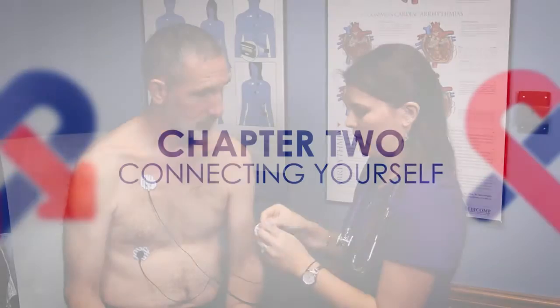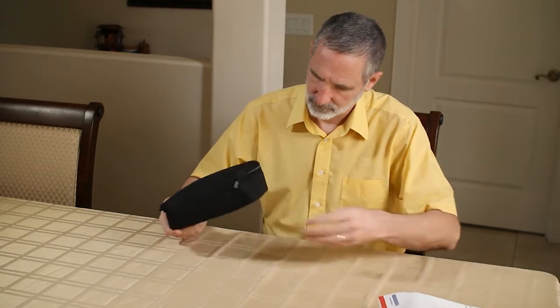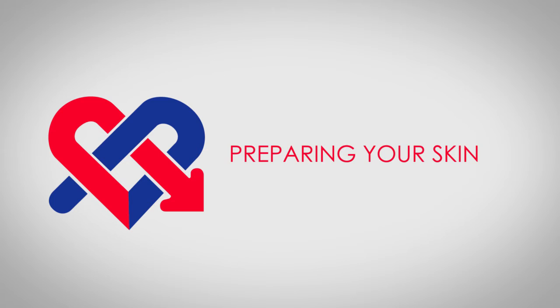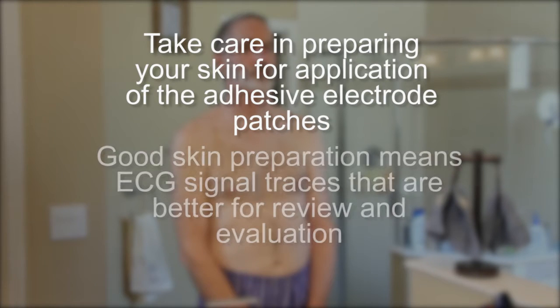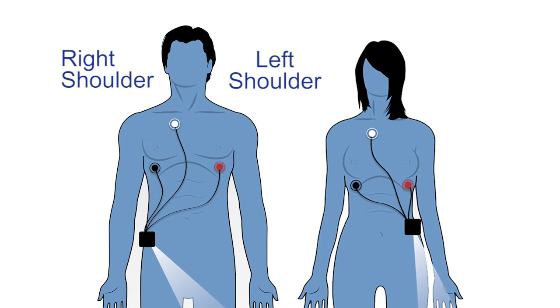Connecting yourself: The doctor's office may have connected you to the monitor, or you may have received the monitor in the mail to hook up yourself. Before applying the electrode patches, follow the steps on how to prep your skin. Good skin preparation means ECG signal traces that are better for review and evaluation. Step 1: Choose areas of the chest that are flat and not very muscular within the areas indicated on the illustration. Avoid skin folds or creases, irritated skin, and scars as best as possible.